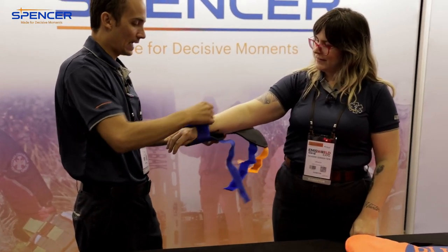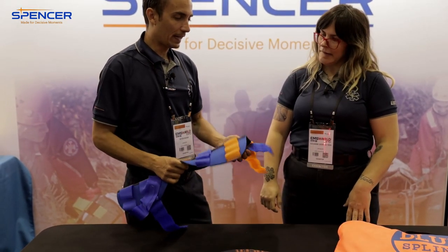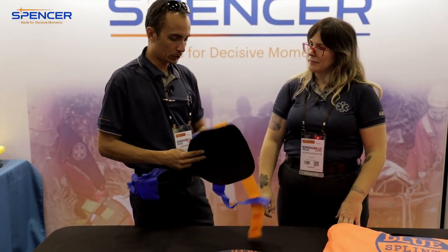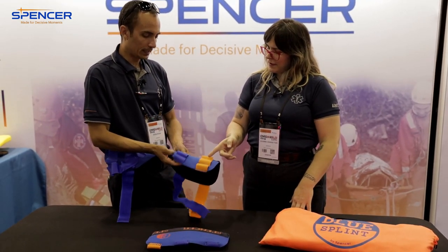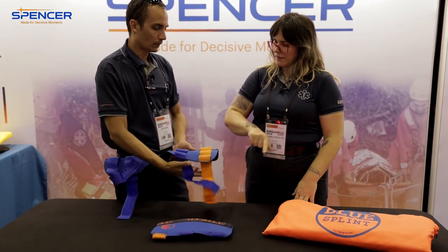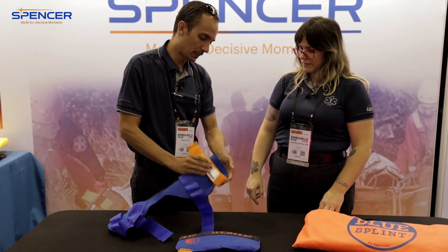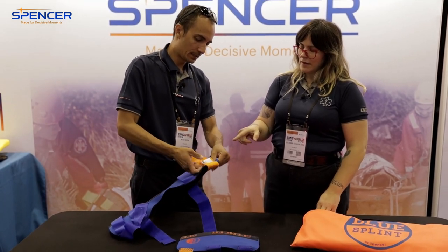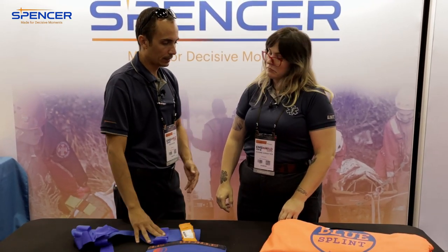You can use these for any different limb or appendage — it's really about how creative you can be with it. Another neat thing is the way they're sewn: as you pull the strap across, it takes up the slack and gives you a little more bite when it pulls back, so you don't have to keep pulling it away from the patient. It's like a progress-capture kind of thing.